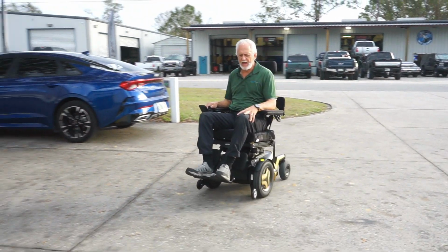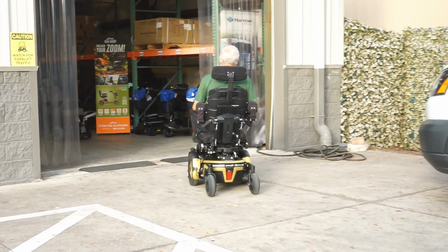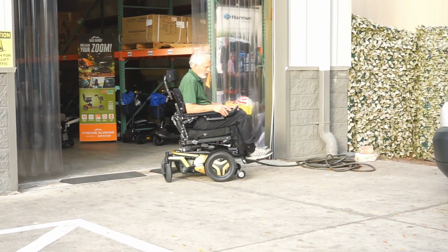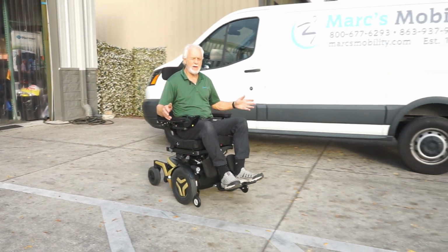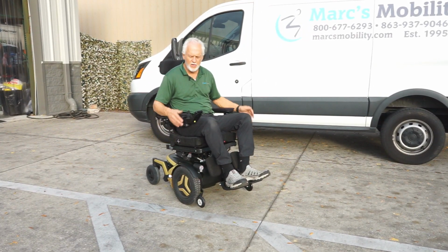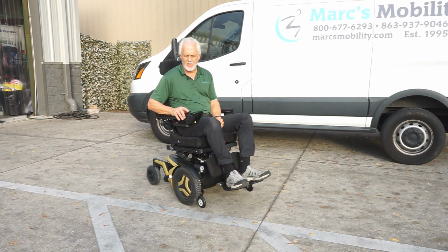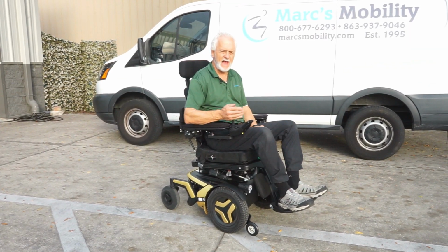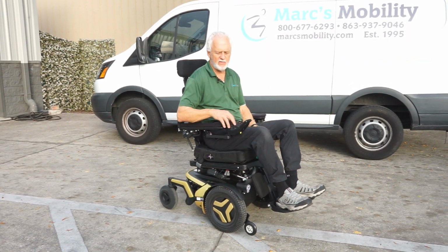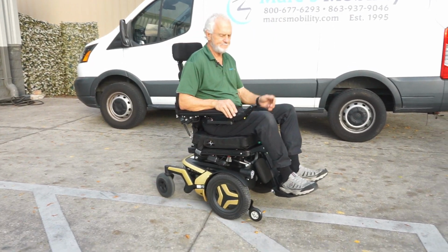This is the Permobil F3 front wheel drive. Really sweet riding chair. And when you stop, it stops automatically. It has built-in brakes in the motors. You can also use the joystick right here. The knob has a gas pedal. So if I push it just a little bit, look, it barely moves. So you can use it as a gas pedal, or you can reduce the speed over here. I use it here at full speed, then I can dictate as I'm driving what I want to happen.